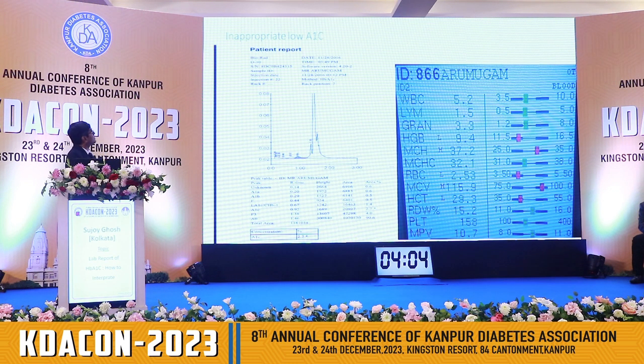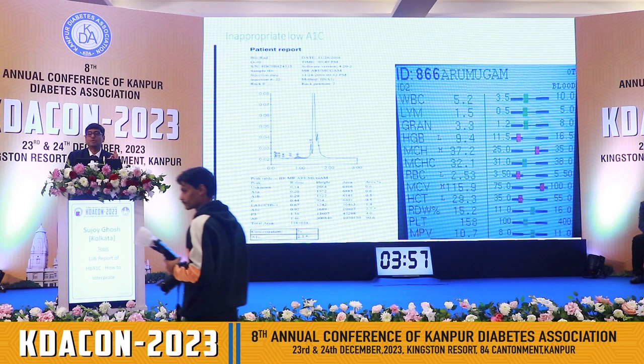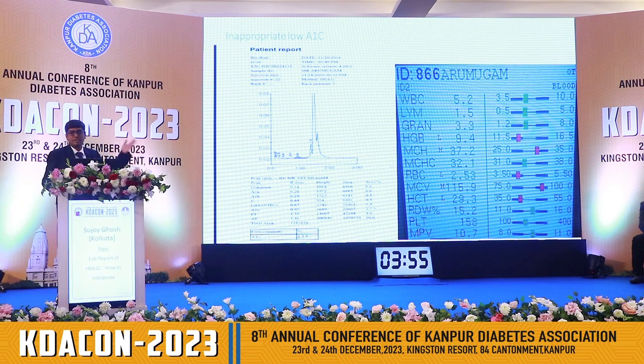Now this is again another patient. You see that the HbA1c is only 2.7%. Now it's always a good idea to interpret the report in the light of the patient, not just see this and understand what is in this patient.